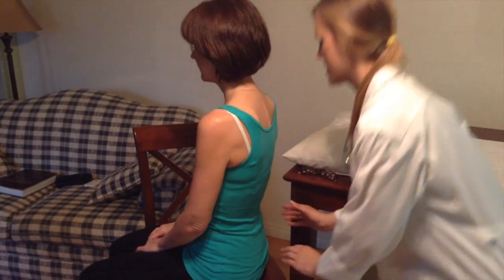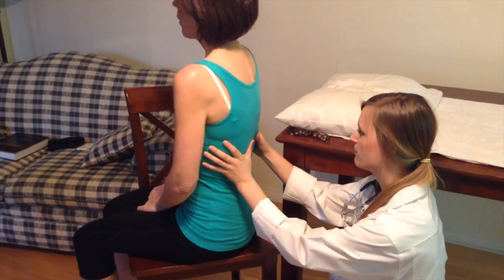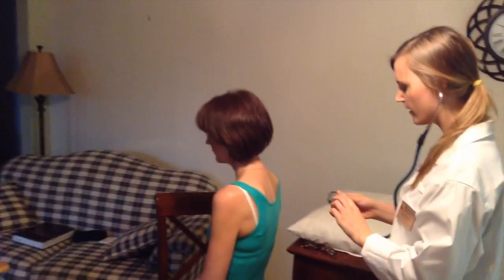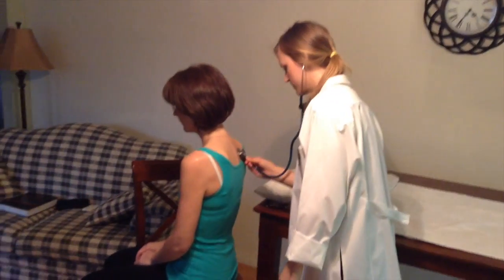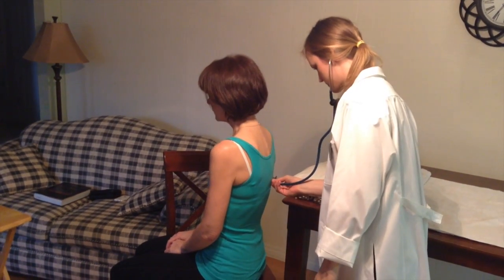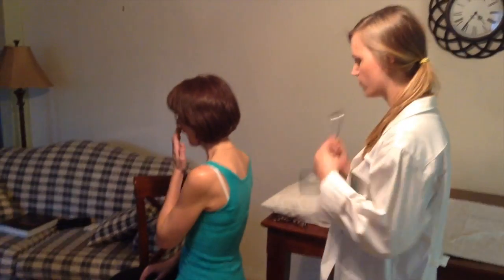Excellent. Now I'm going to put my hands on the lower part of your back and watch for your respiratory excursion. So if you could just take a big deep breath for me. And now, perfect. Okay, I'm going to listen to you in 6 places along your back. As I move my stethoscope, if you could just take a big deep breath for me. Okay? Nice and clear and equal breath sounds.